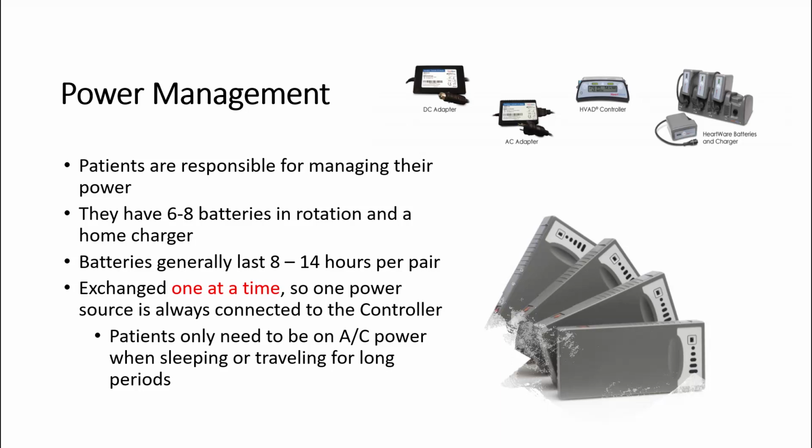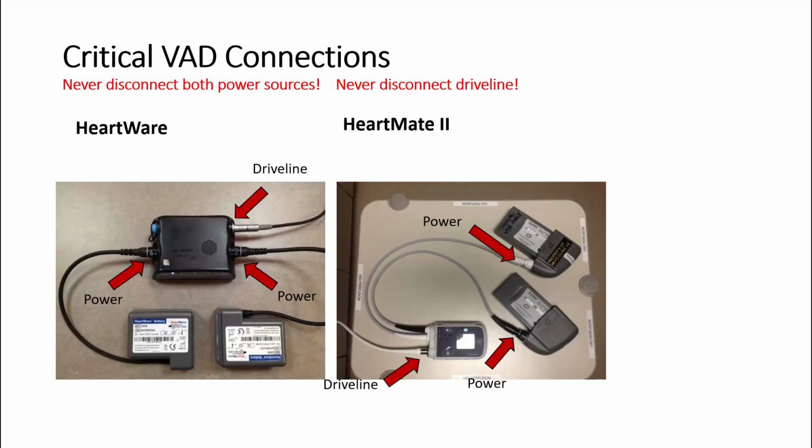Okay, enough about the things that power, per se, the LVAD. Let's talk about the connections. And when we talk about connections, I'm not just talking about the connections from me to you, the connections we form under stress, under duress, in the blood and the mud, although that brotherhood and sisterhood is definitely there. Today we're going to just talk about simple everyday connections of power from the LVAD to the LVAD control, or from the batteries to the controller, and therefore through the controller to the drive line and the pump itself.